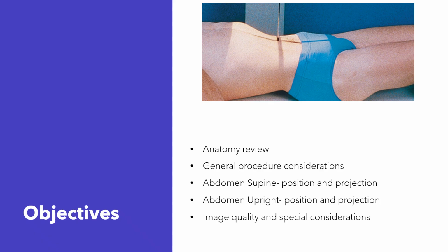But as far as the abdomen, you don't have to know necessarily the left and right lobe of the liver. You have to know that the big gray triangle in the upper right hand corner of the radiograph is the liver. You have to know where the kidneys are. And really the anatomy and the diagrams, I do want you to know that, but it's more important that you know radiographic anatomy. That is, you look at an x-ray of an abdomen, flat plate, KUB, like we see here in this picture.